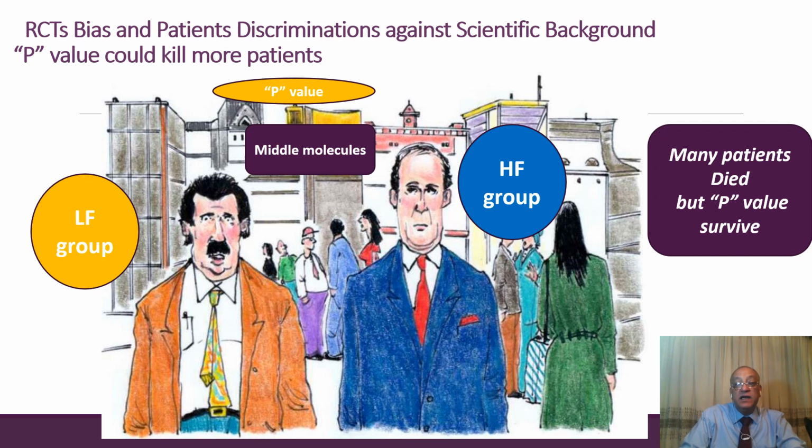The dialysis research on randomized controlled trials had many biases before when comparing low flux against the high flux dialysis membrane. I think nowadays all modern countries are using high flux, and it is either high flux dialysis or hemodiafiltration, so there is no way to return to low flux dialysis.